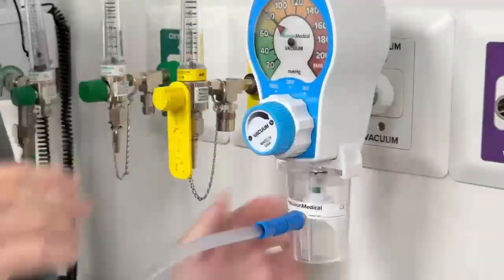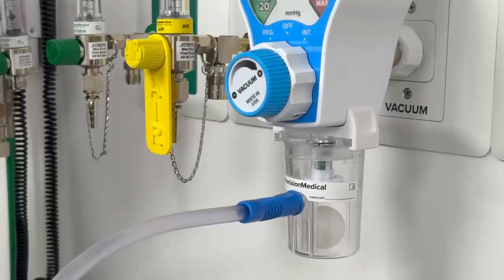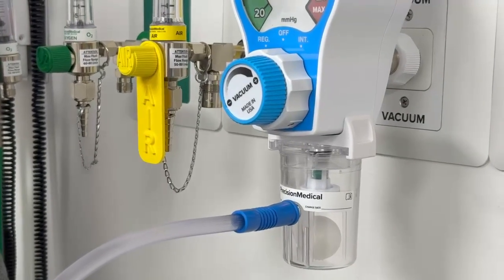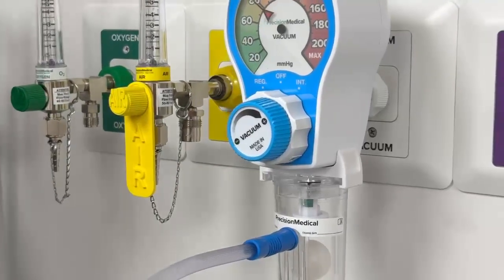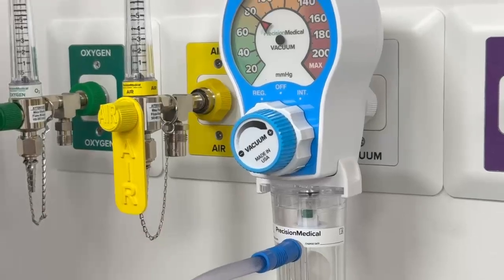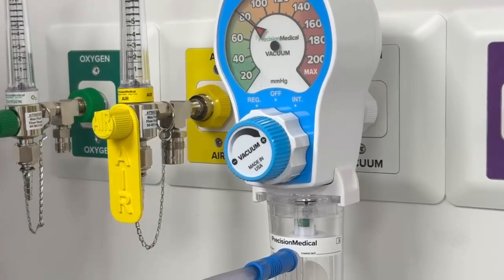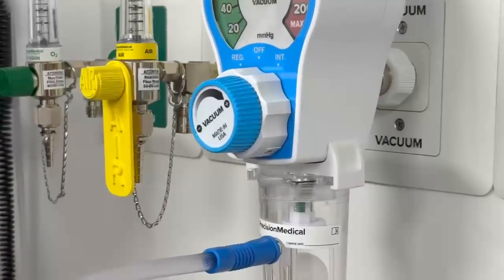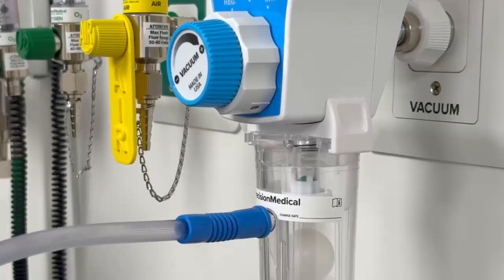Turning it on, you can see that we have positive flow. While performing endotracheal tube suction or if it's on a nasogastric tube, you can see that as long as that green ball is visible — it only takes minimal flow, three liters a minute — to be able to see this green ball. If I occlude the system, like during tracheal suction or if something happens during nasogastric suction where this becomes occluded, you can see that the green ball disappears from view.